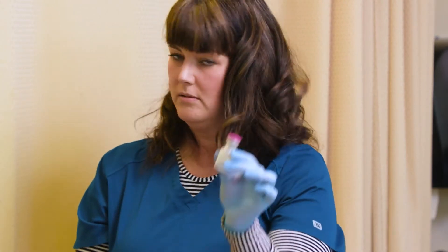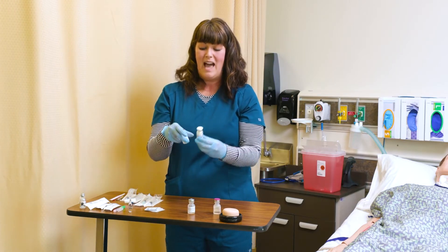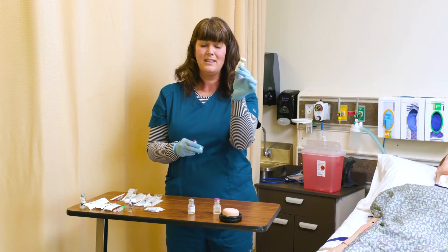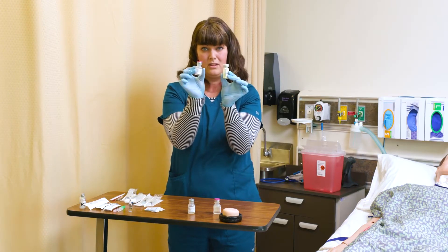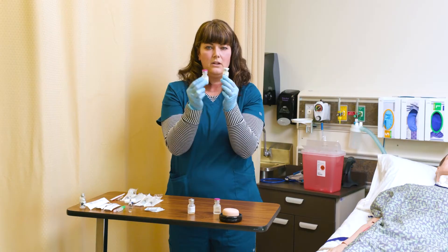Sometimes medications will come in different forms. They can either be a straight solution in a vial of medication, or they come as a powdered substance that needs to be reconstituted with a different type of diluent — sterile saline or sterile water.